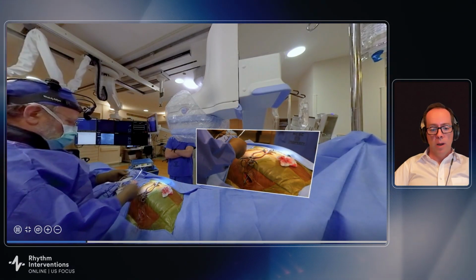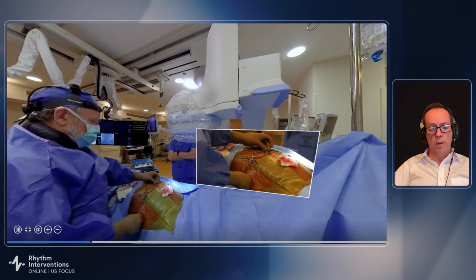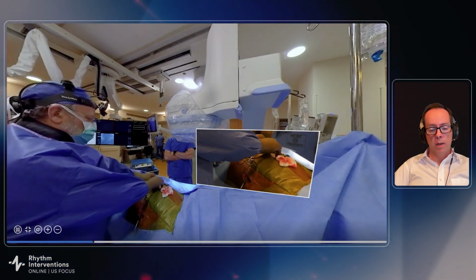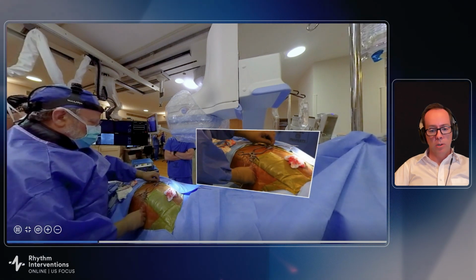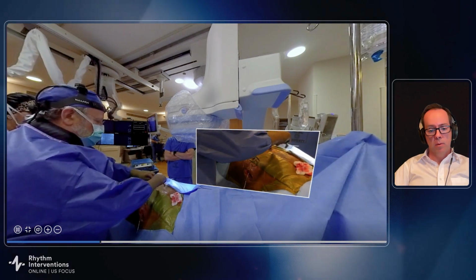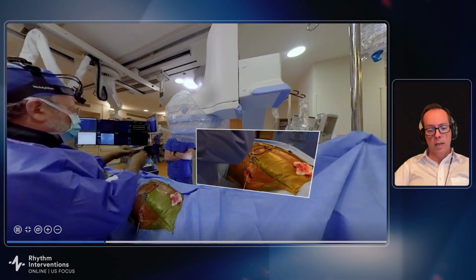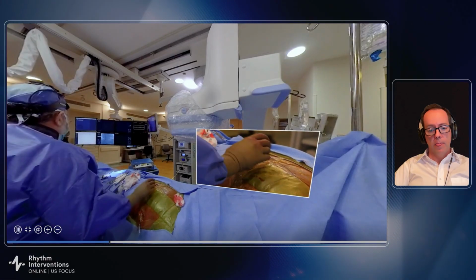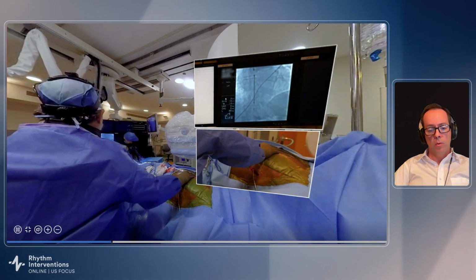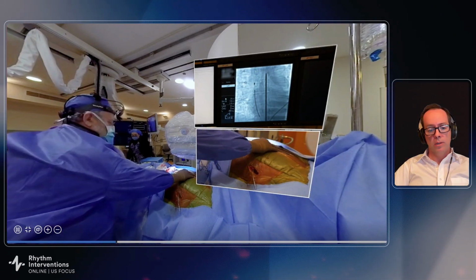The paraxiphoid pocket here is as important as that big lateral pocket. Now he's already tunneling. This seems to be going in fast motion. He's already tunneled and peeled away. I pre-throw my Ethibond ties in the paraxiphoid pocket beforehand, and I put little snips on them to localize it.